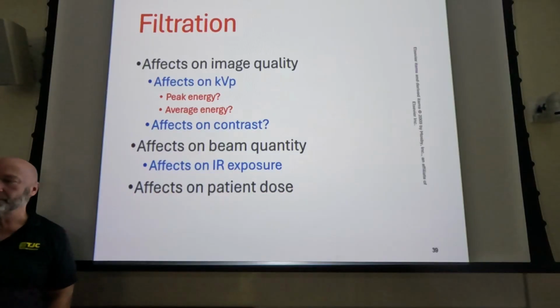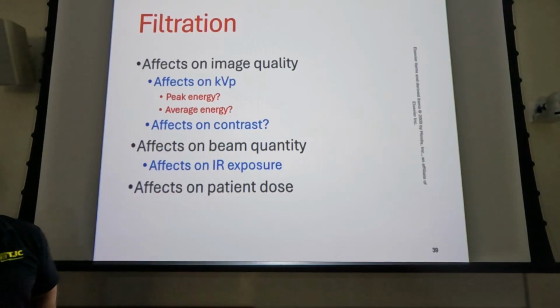Effects on patient dose, though. We have a higher energy X-ray beam, more penetrating X-ray beam. What type of interactions increase the patient dose the most? You got 3. Essentially, you get scatter radiation, which is partial absorption. You have penetration without interaction. You have total absorption. Which one of those 3 adds most to the patient dose?